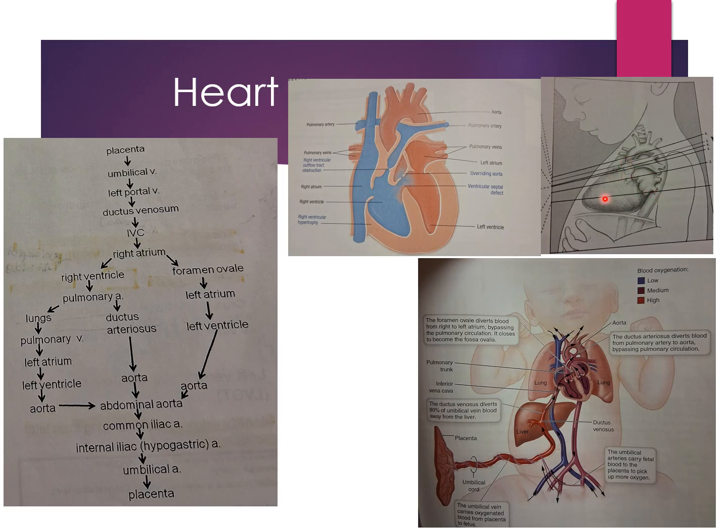So when we're going up through that left ventricle into the aorta, we are going anterior to posterior. And so our camera is going to stay along that route, going at an angle. Please notice that it is not straight across, it is on a slant. Okay, now let's go ahead and take a look at the associated images that we're going to get with it.